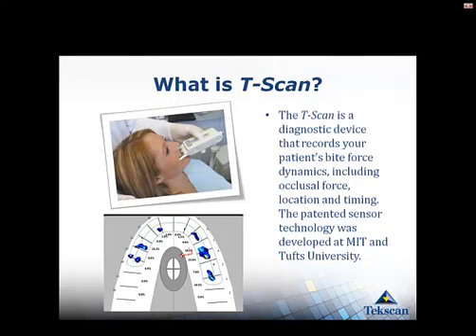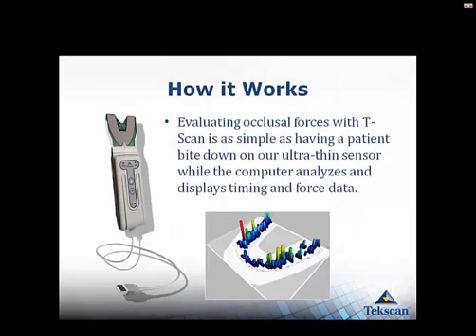If you're interested in learning more about the sensor technology, I highly recommend that you check out our website at tekscan.com. Although the sensors were originally developed for dentistry, they are used in thousands of different applications across the world. So it's really interesting to check out where else people are using these sensors.